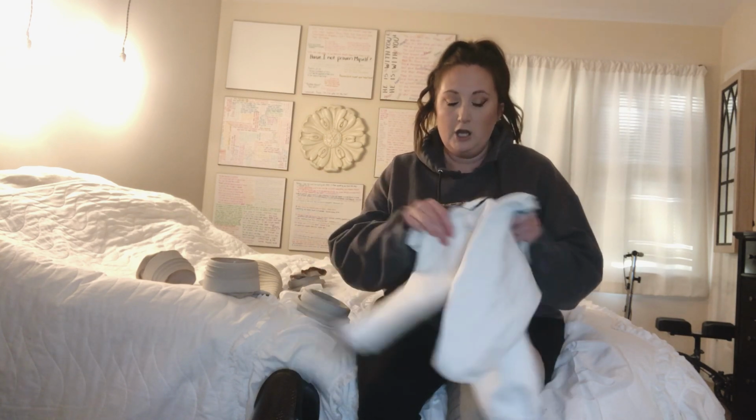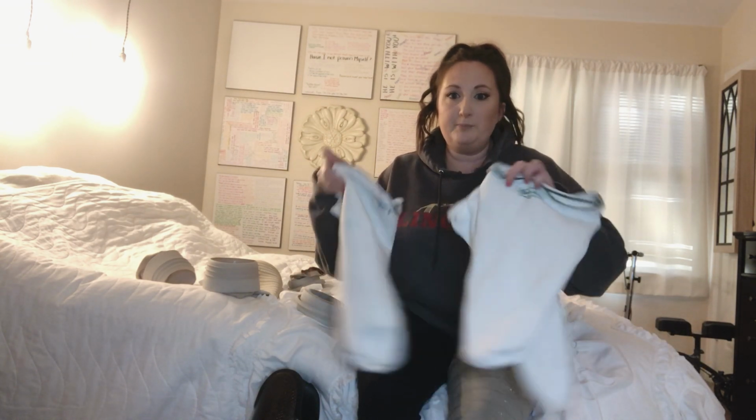In order to do that, I'm going to put on various size socks. This one is a 5-ply, this one is a 3-ply, this one is a 1-ply, which is basically the thickness. You can double, triple them up, get any combination you want, like this is an 8, this is a 6, this is a 4, and so on and so forth.